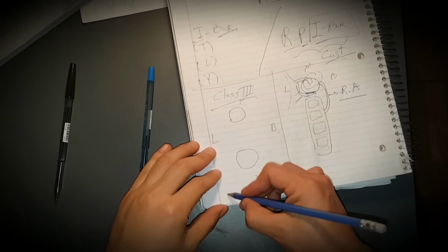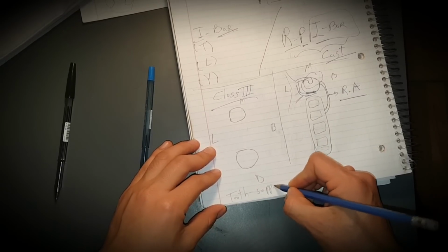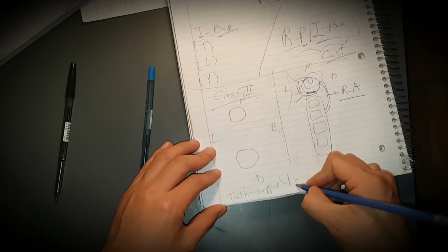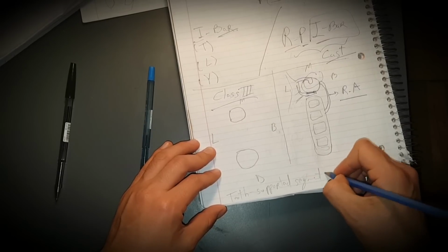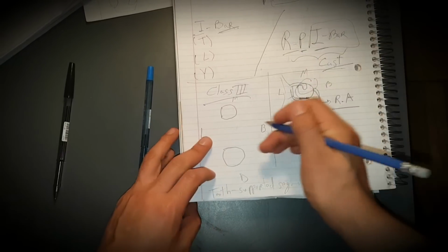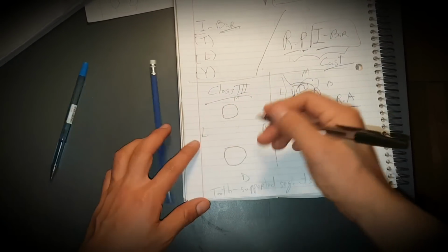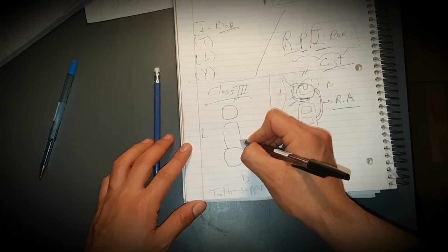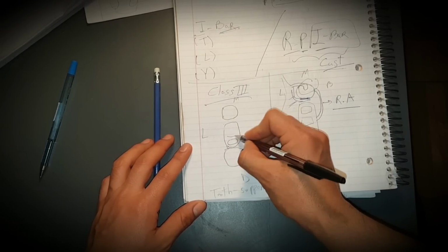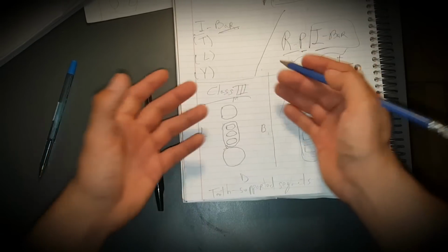So we're talking about tooth supported cases, or supported segments. We're not talking about fulcrum lines or anything yet. Here again, I have my open lattice work, 1, 2, whatever. And then we draw it again.